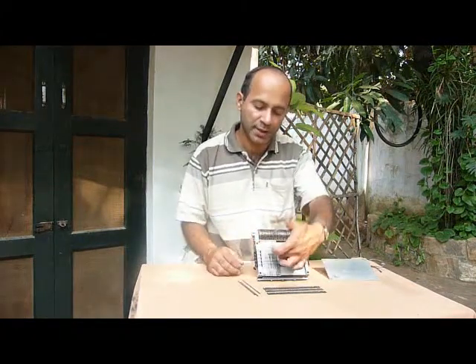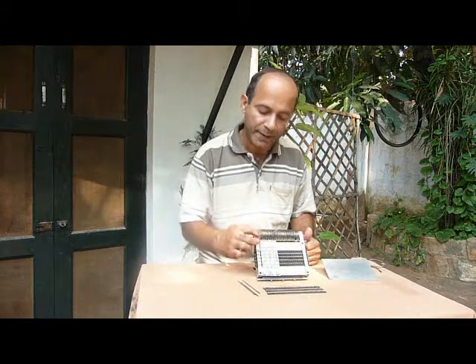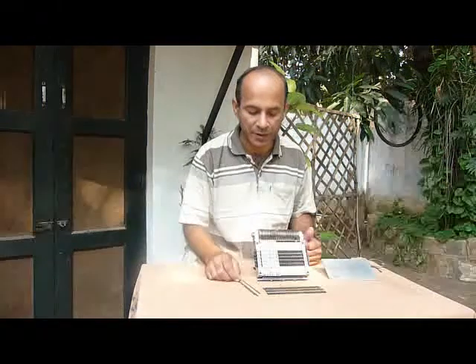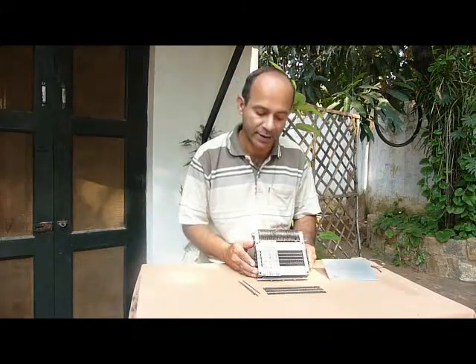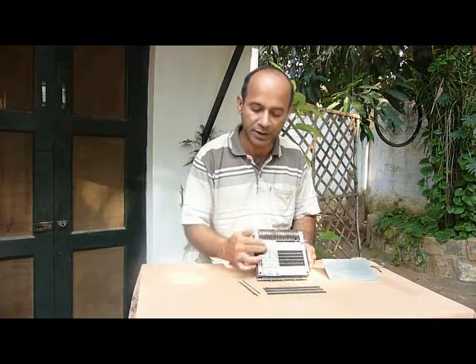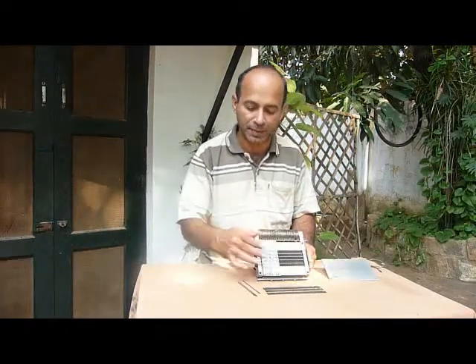So assuming, say, the third slide is open, the first and second are closed, and the fourth and fifth onwards are all closed. So when the row slides move underneath, closed the columns that are disabled, there's no change to any pins in that area. It's only the column that is enabled, the pins drop and are set.